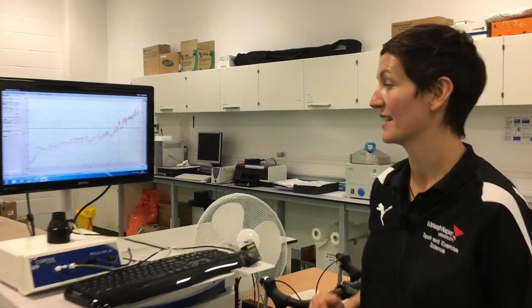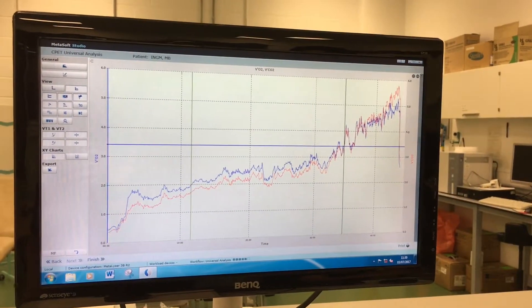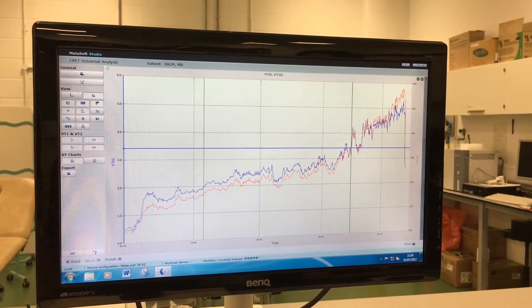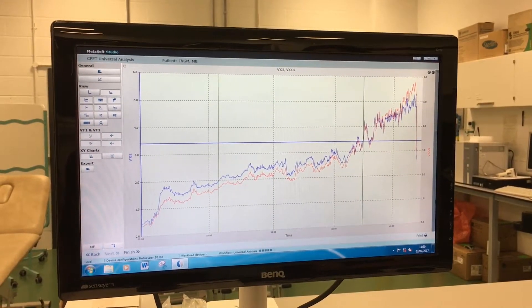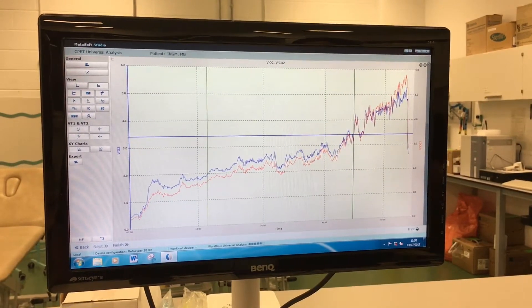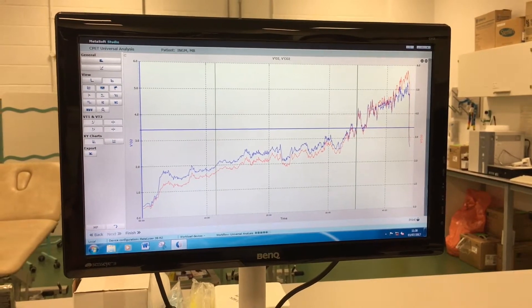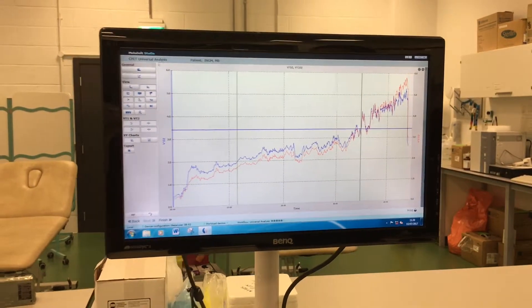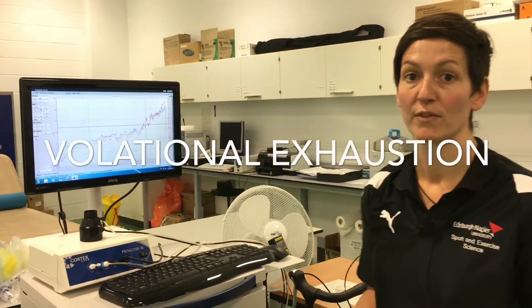Over here is the test I performed with Mark. You can see through the early parts of the test the blue line is the oxygen he has expired and the red line is the carbon dioxide. As the test goes on, you can see that the carbon dioxide actually takes over the oxygen, and that's the point where Mark is not going to be able to sustain that exercise for much longer — that's what we call volitional exhaustion.